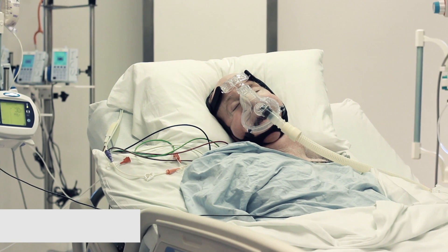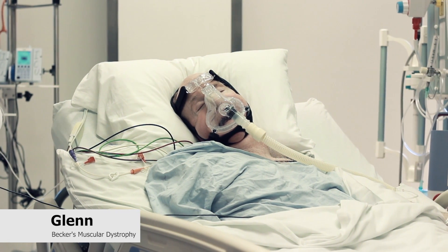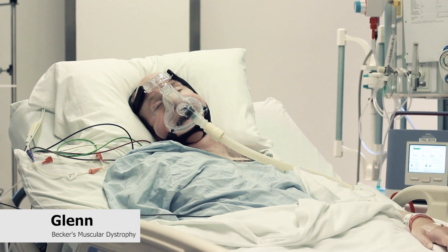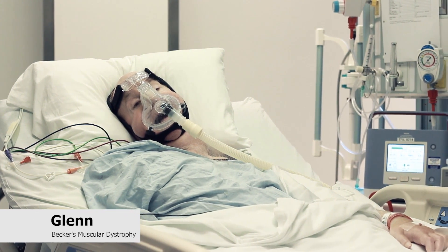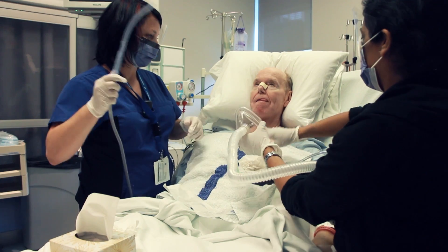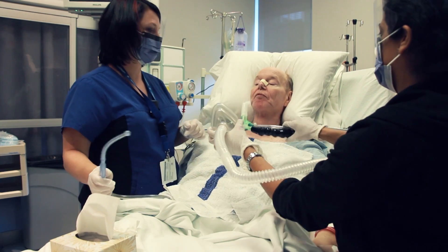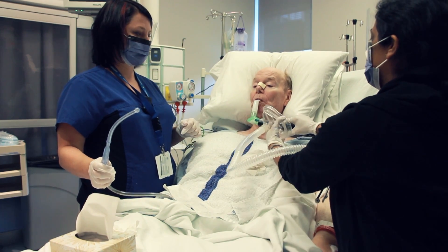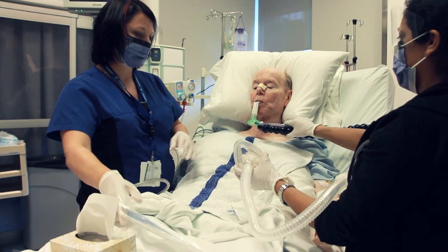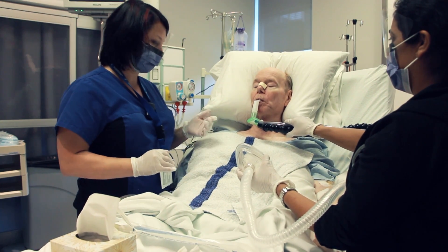Glenn has Becker's muscular dystrophy. Prior to this hospital admission for a condition other than respiratory infection, he worked full-time in accounting despite being 24-hour non-invasively ventilator dependent. During his hospital stay, he naturally developed general weakness. However, invasive ventilation was avoided in part because of daily access to mechanical insufflation exsufflation to clear the mucus from his lungs.